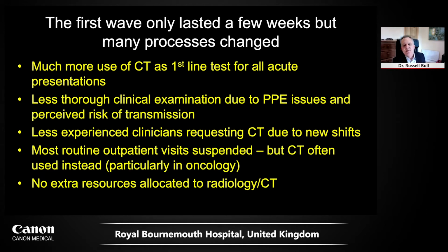Much, much more use of CT as a first line test for all acute presentations. Much less thorough clinical examination happened, partly due to PPE, people were wearing equipment, and the perceived risk of transmission. So people weren't being examined. Less experienced clinicians were requesting CT, and they were requesting CT in areas that weren't theirs. We had surgeons requesting CT for the chest. This is perhaps not a good thing.